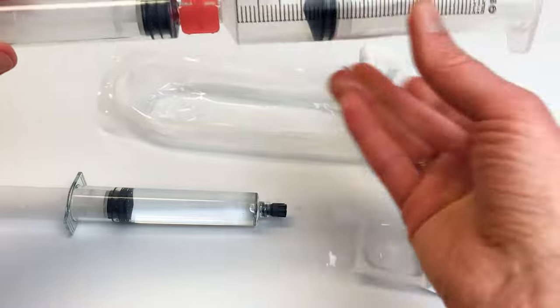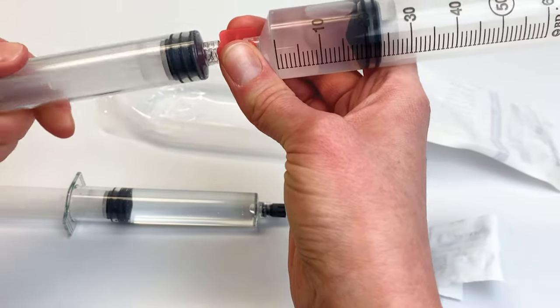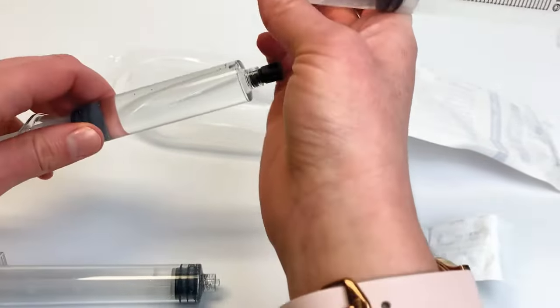If using more than one pre-filled syringe, remove and attach the second dose following the same steps.